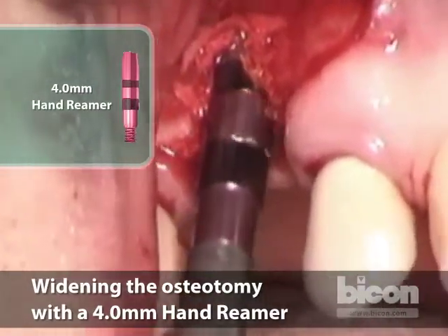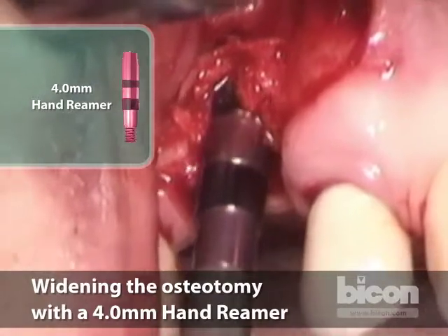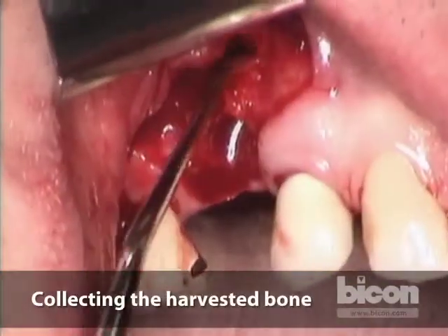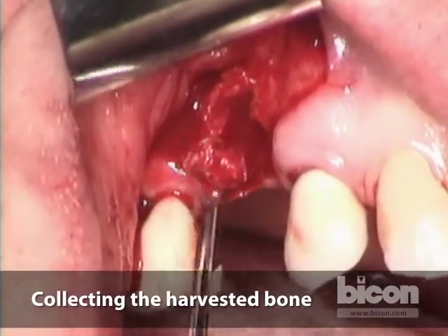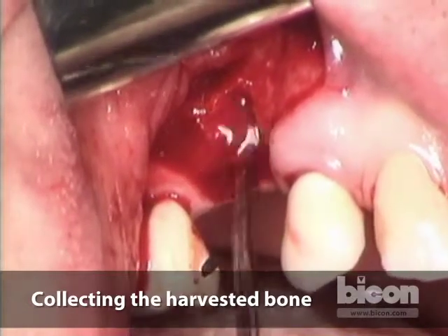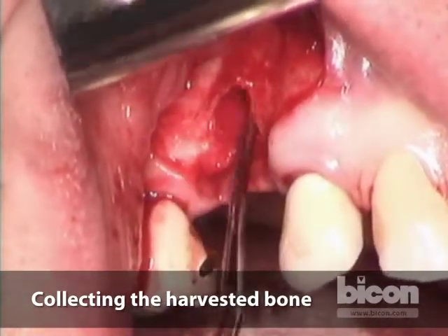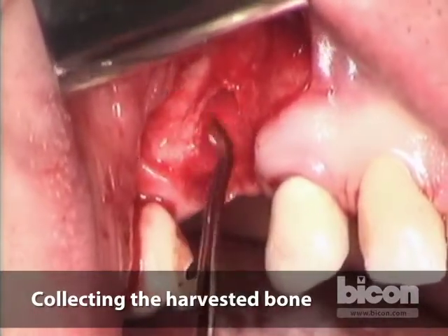Now, the one thing about the hand reamers is with the proper vertical pressure, we can increase the depth of the osteotomy slightly. And we're collecting quite a bit of bone. So all of this bone, all of the splinters of bone that we have, all of these are useful. They're corticocancellous, autogenous bone that come free. Okay, suction now. Let's get all of the loose parts off. If they're still attached, I won't really traumatize them.